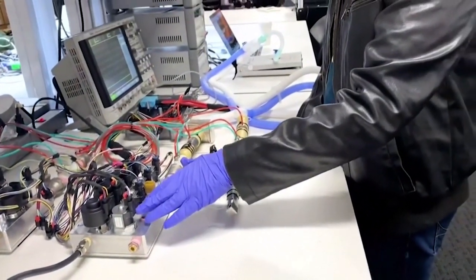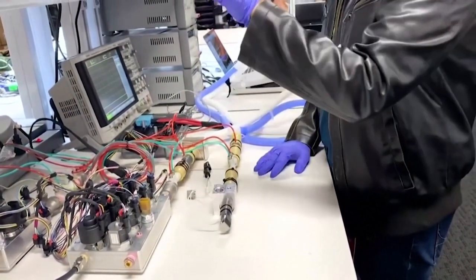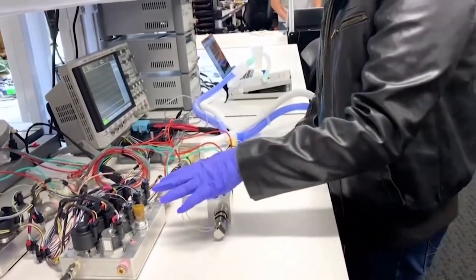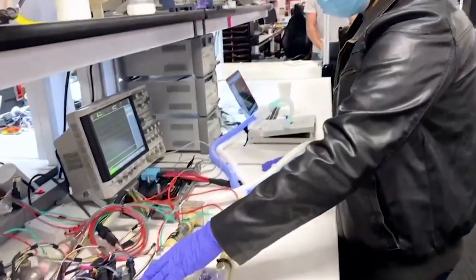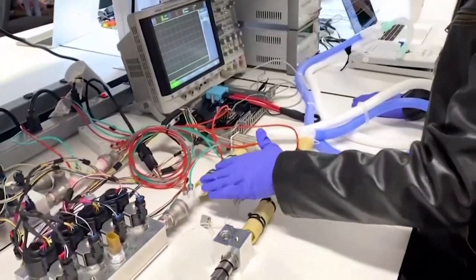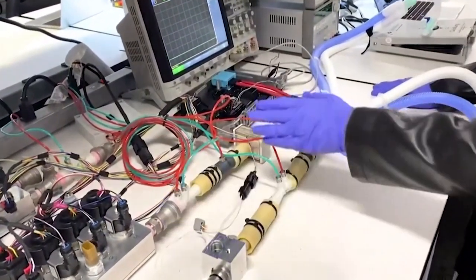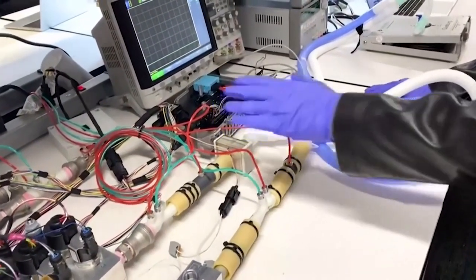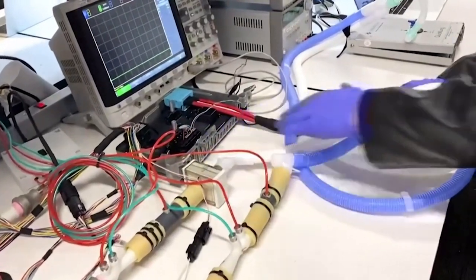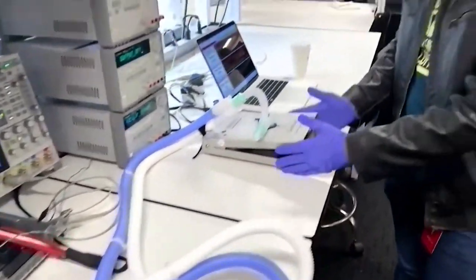This unit is used to create a waveform, the pressure waveform. Then the air goes through the control board which has sensors. So this is a flow sensor, this is a pressure sensor. Then it goes to a filter, it goes to a test lung.